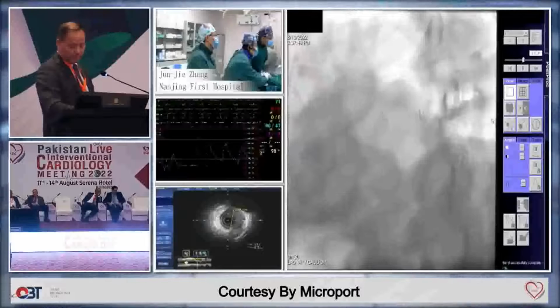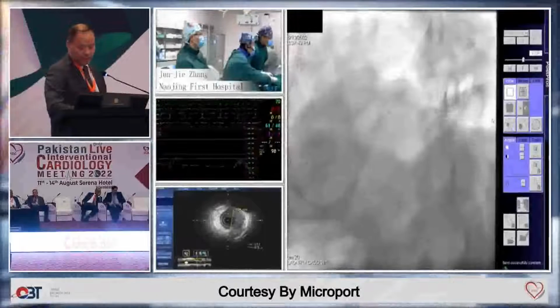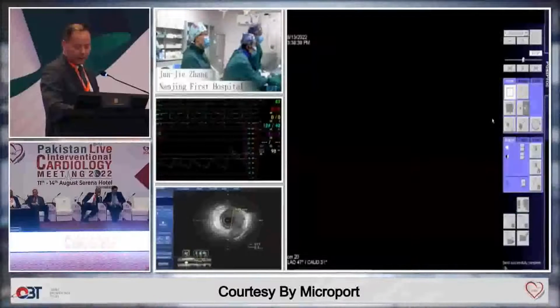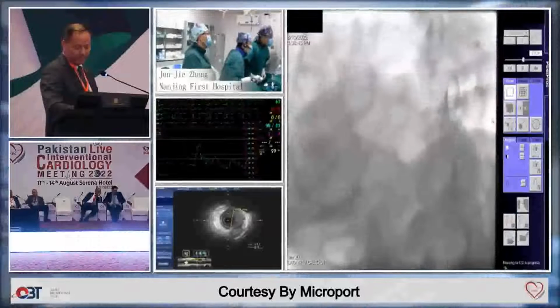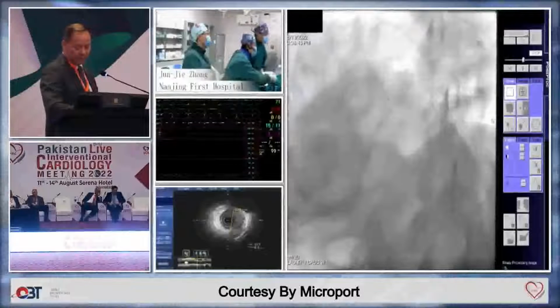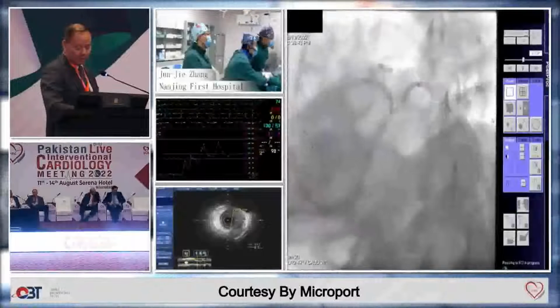Yes, please. I think you can put the balloon as distal as possible. Thank you very much for your suggestion. Yes, Prof. Okay, good position.